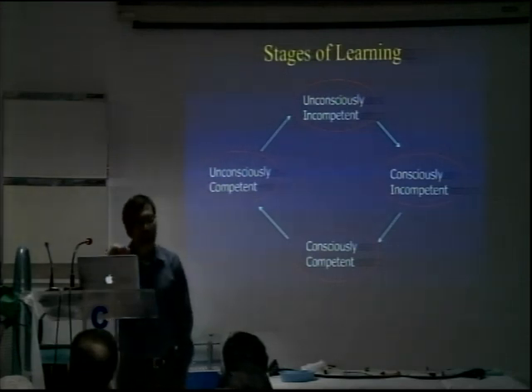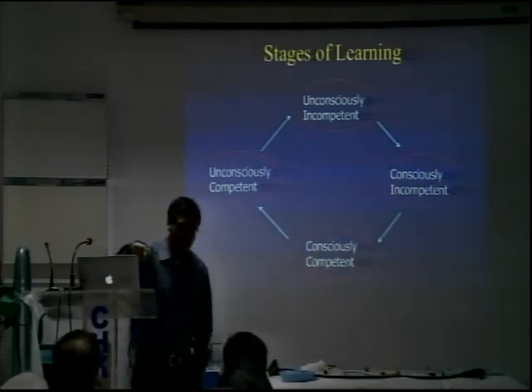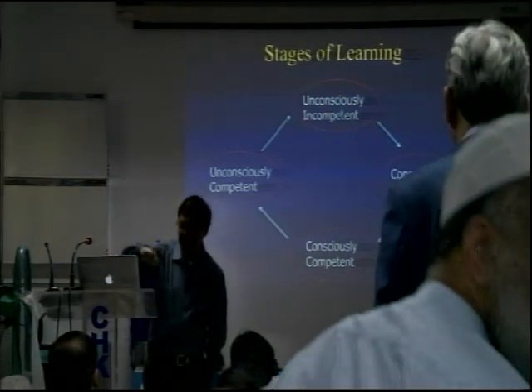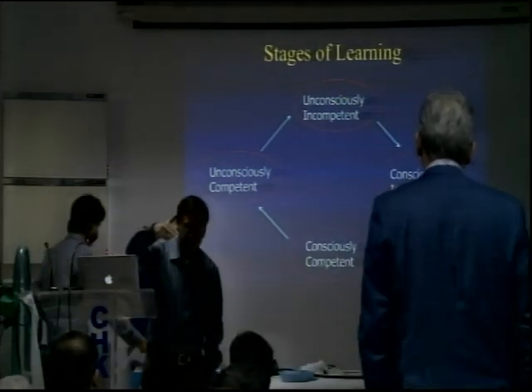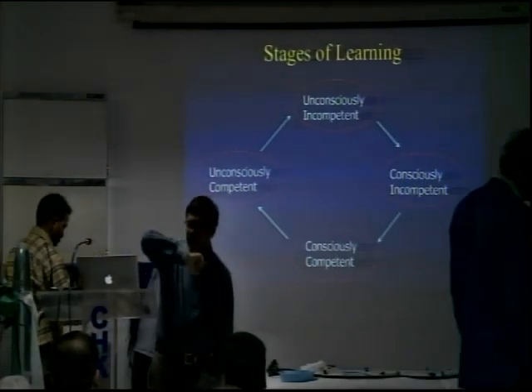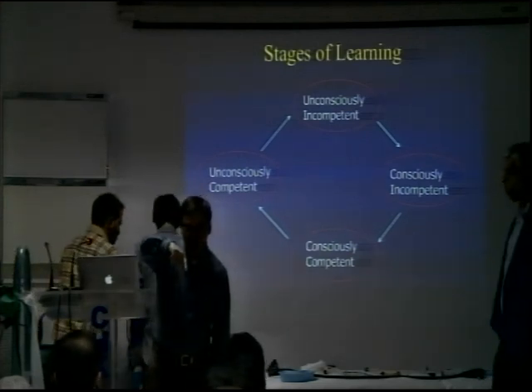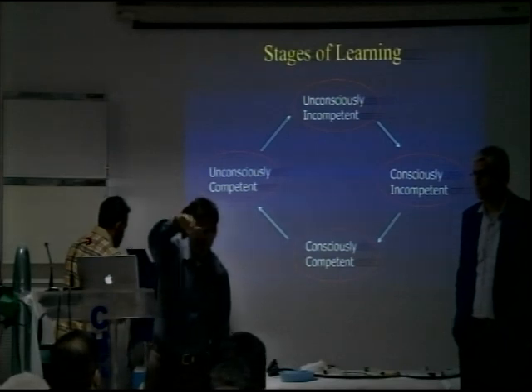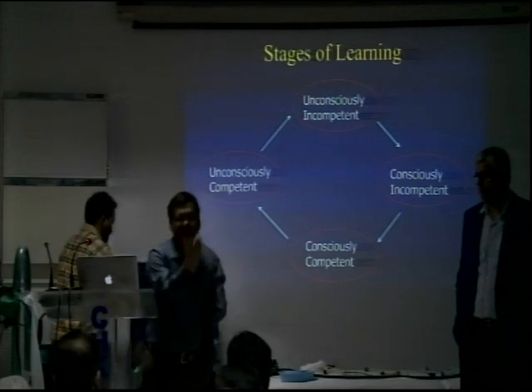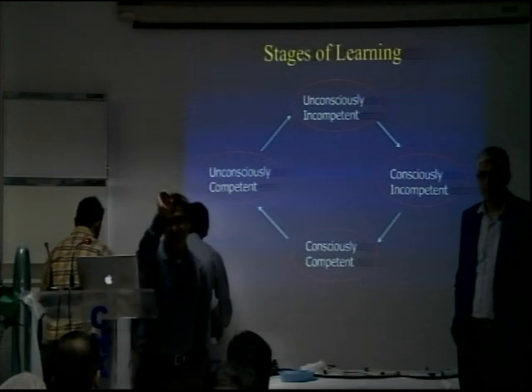You keep getting into the pancreatic orifice, and you want to get into the bile duct. So there is a technique called a septotomy. You use a sphincterotome and give a very superficial cut. It's not a cut to the sphincter, it's a cut to the mucosa, to expose the upper end of the septum. Usually you end up getting into trouble rather than helping yourself. You make the opening bigger, you do a pancreatic sphincterotomy, and now you're stuck with that.